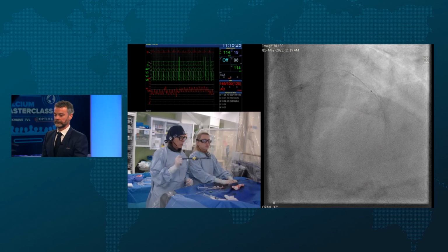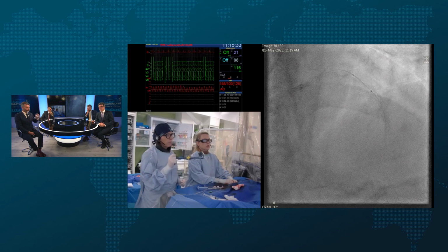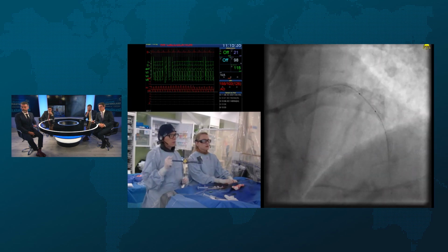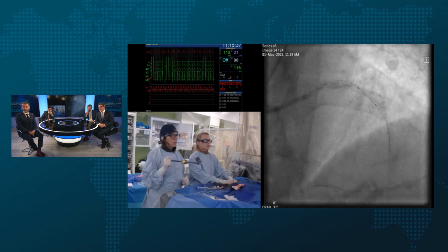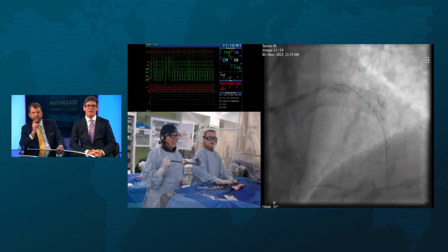That's a great point. Yeah, I mean, I think this is a 38 based on your previous IVUS. Why don't you IVUS and just show us? Yeah, we could re-IVUS. Yeah, please. It'd be interesting to see the distal vessel. I think you just saw a hand there because the pulse pressure got a bit low. But yeah, he'll be all right. I've backed everything out again.